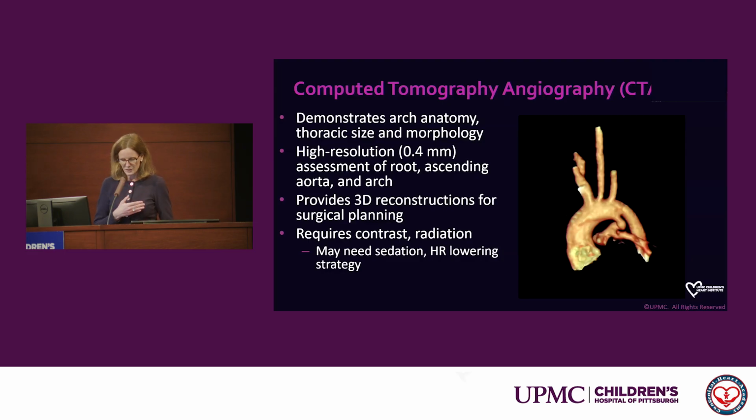As we know, CT pretty much always involves contrast exposure, always involves radiation exposure. And then for smaller children, if CT is selected as your cross-sectional modality, you may need sedation and may actually need a sedation strategy that involves cessation of respiration, so potentially general anesthesia. And then people of any age, depending on how you're going to image, may need a heart rate lowering strategy.